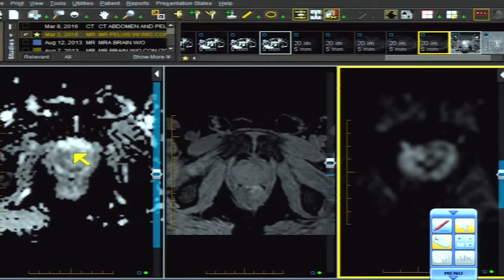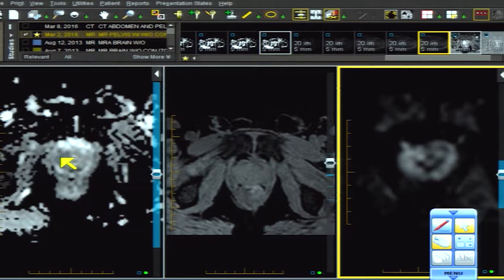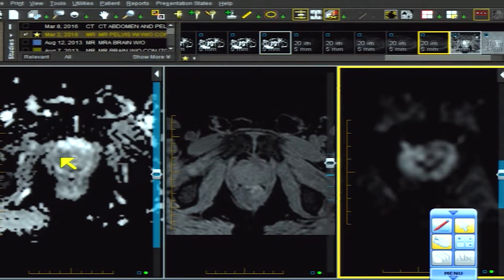The ADC map not only demonstrates areas of low intensity, but these low intensity areas have to correlate with something. Areas of confluent mass-like hypointensity also have to correlate for it to be a PIRADS 4 or 5 with hyperintensity on diffusion weighted imaging. If you see low signal intensity areas like this but the DWI is negative, then it's no longer a PIRADS 4 or 5 diffusion weighted designation.